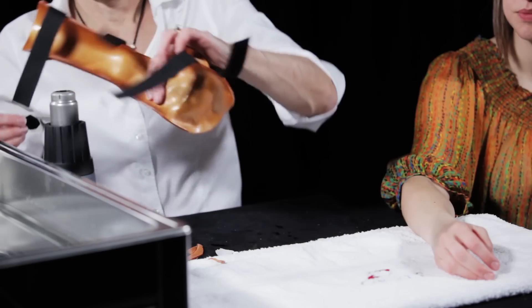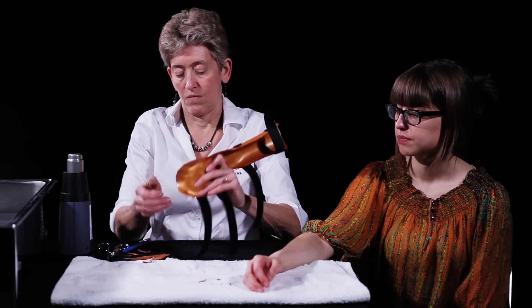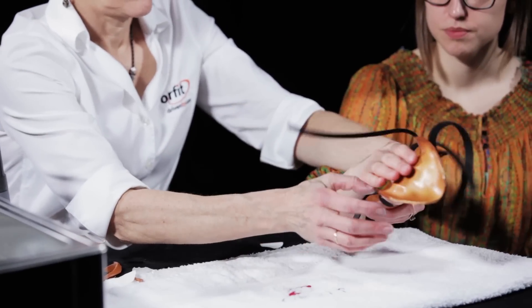Apply adhesive backed Velcro hook on the opposite side of the orthosis. Make sure this hook stays in place by dry-heating this adhesive and also by dry-heating the thermoplastic material.